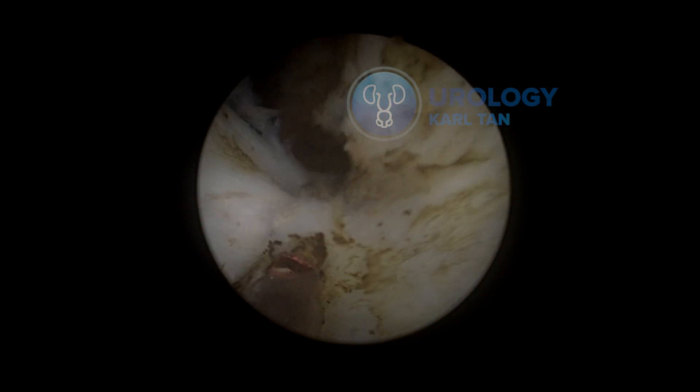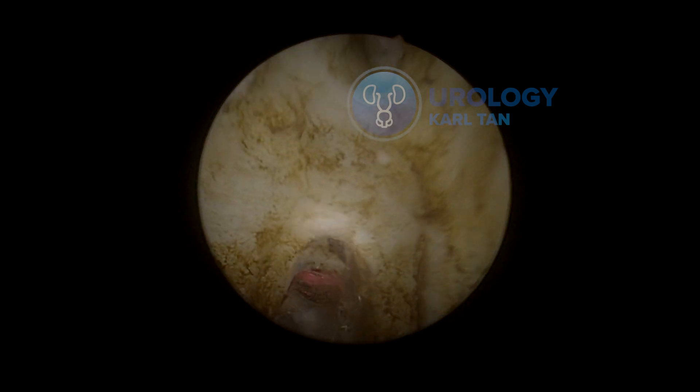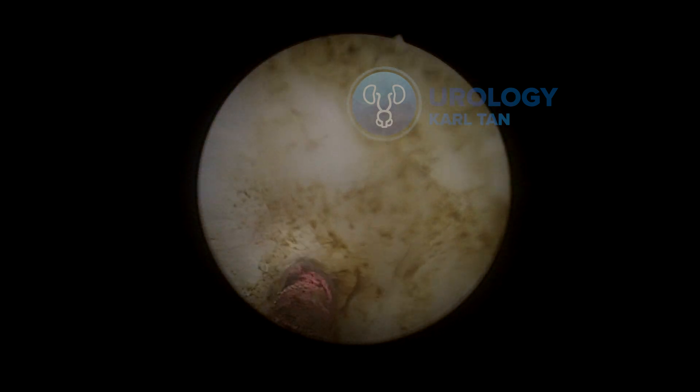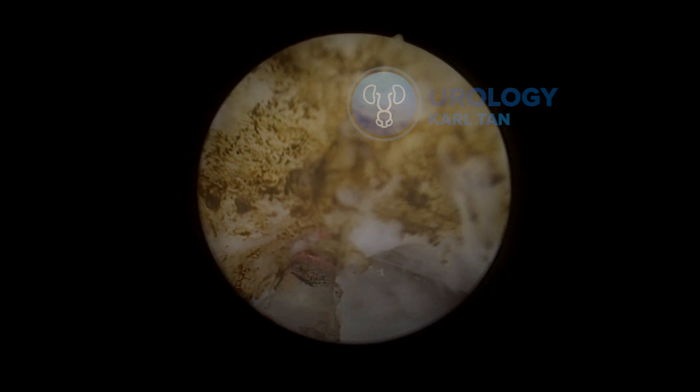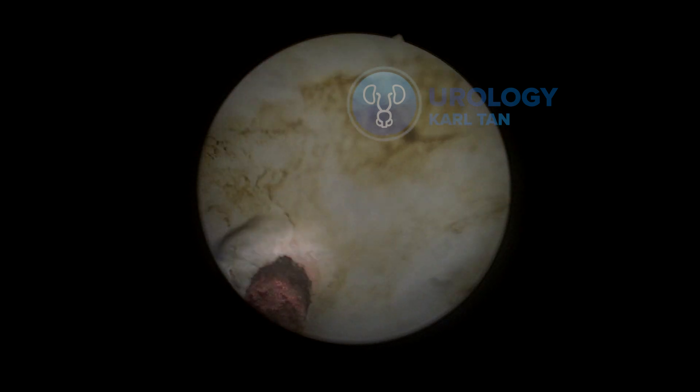We're already nearing the end of the enucleation part. You can see there are only a few attachments of the left lateral lobe and median lobe to the capsule. We can see the familiar attachment point and use the laser to release it. The direction should always be going up — never purely forward, always slightly slanting forward but primarily upward. This tip will help you when you're trying to release the posterior lobe of the prostate.